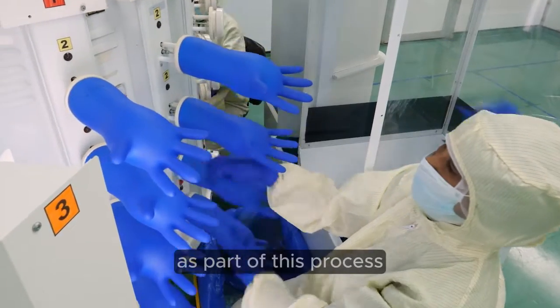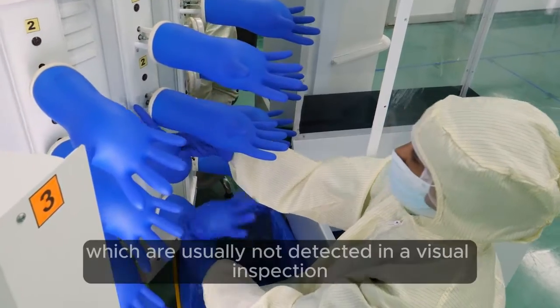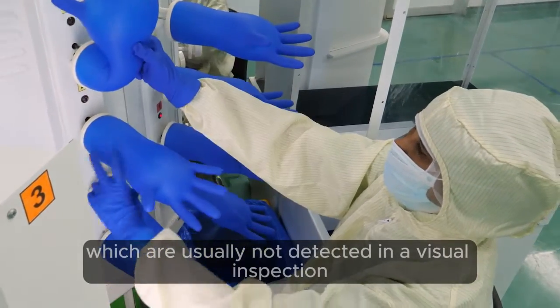As part of this process, every single Biogel glove manufactured is air-inflated to test for holes, which are usually not detected in a visual inspection.